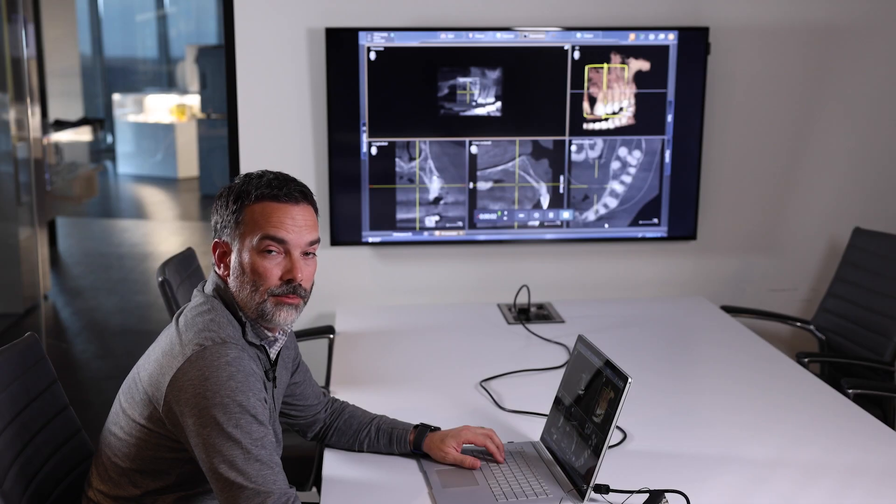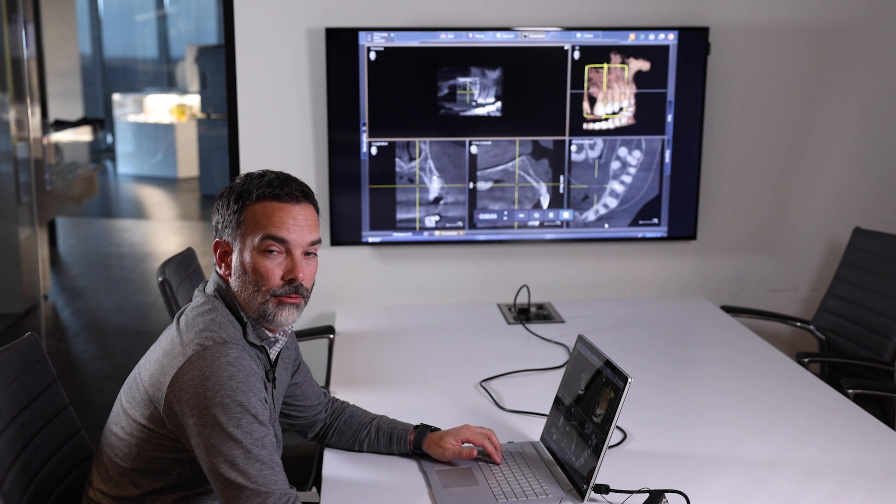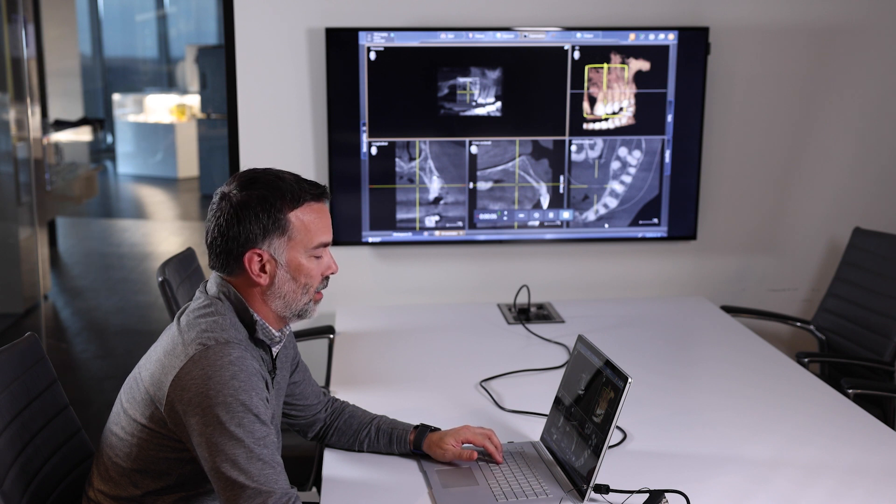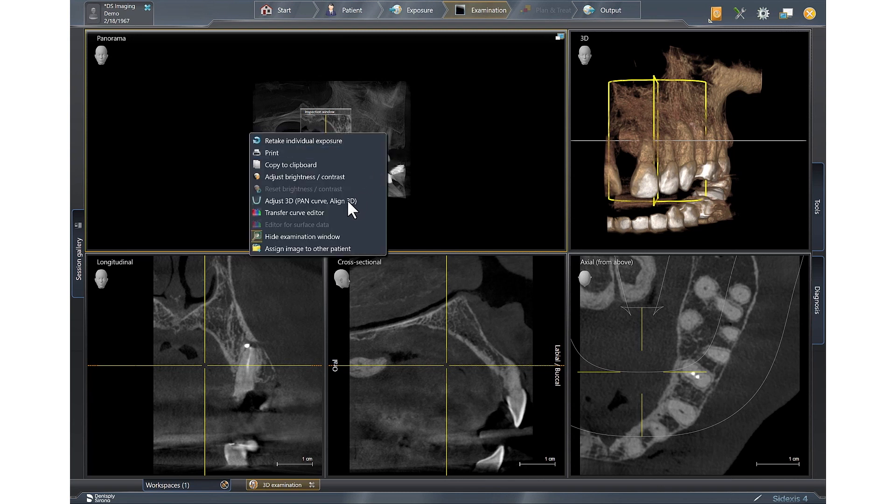Every 3D volume must be optimized to improve diagnosis and image quality. In the pan window to optimize, we're going to right click and select adjust 3D pan.